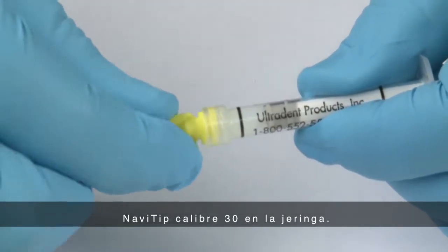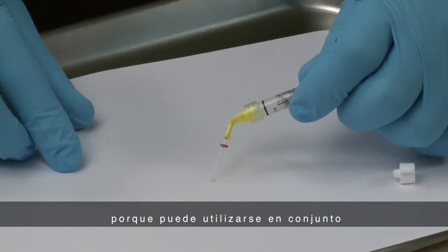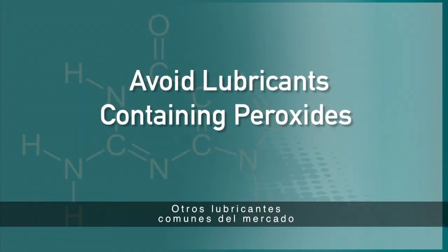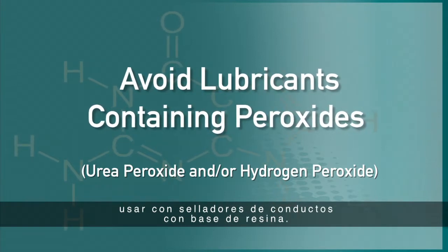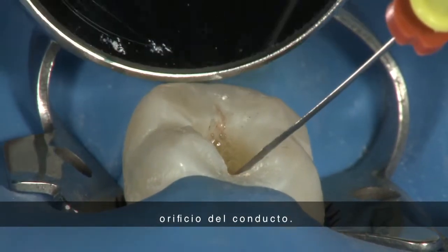tip on the syringe. File-Eze is considered a universal lubricant because it can be used in conjunction with any obturation method. Other common lubricants on the market contain peroxides, making them unsuitable for use with resin-based canal sealers. Place a small amount into the orifice of the canal.